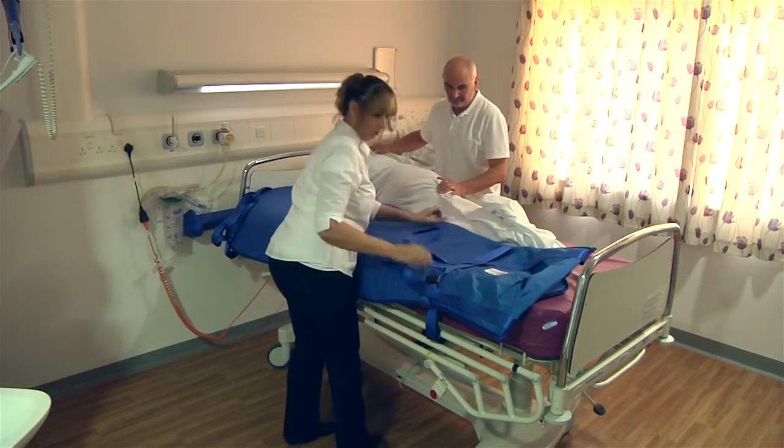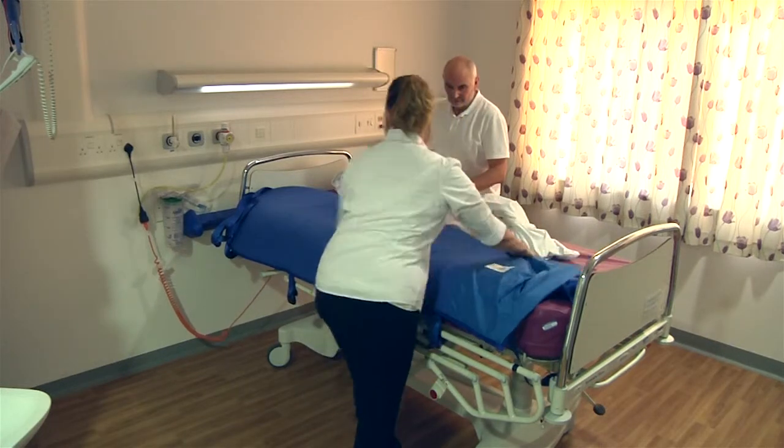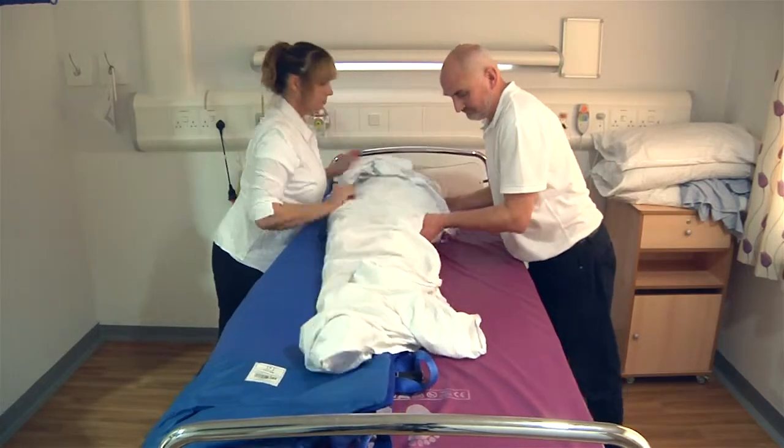Carefully place the ski sled with the black buckle facing the patient, then gently roll them back onto the ski sled.